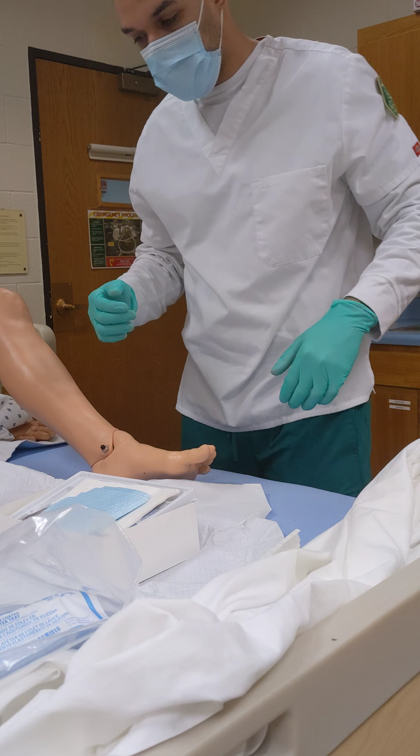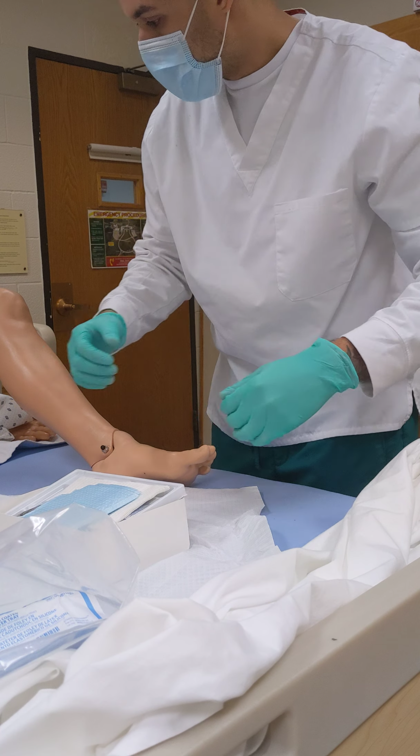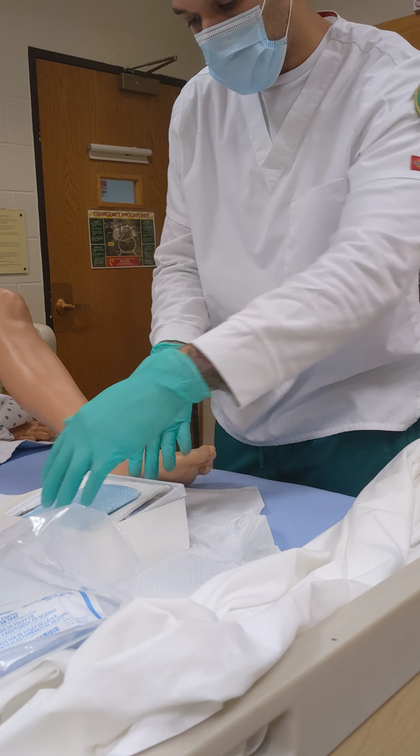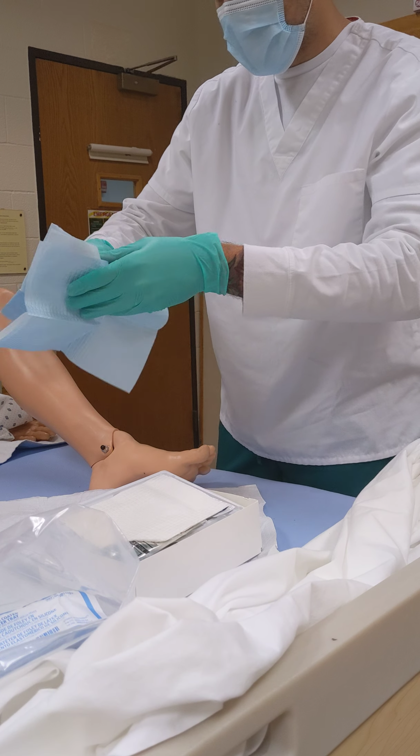Okay. And I have sterile gloves on, I can touch the inside of here. To adjust this, I'm going to place down my sterile field, white side up.